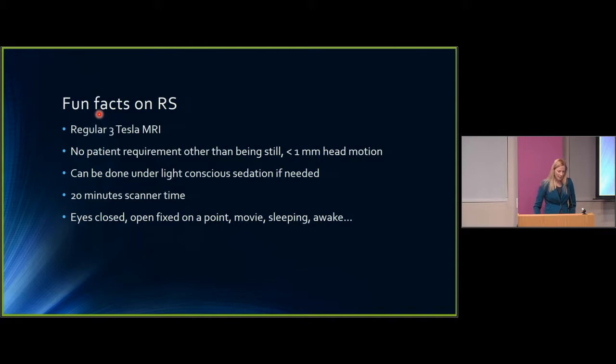So these are just some of those fun facts that it's just sort of easy to get from the standpoint that we don't require the individual to perform anything in the MRI machine. And typically for children, because they have difficulty laying still for 20 minutes at a time, they are generally receiving conscious sedation that is administered through our anesthesia department.